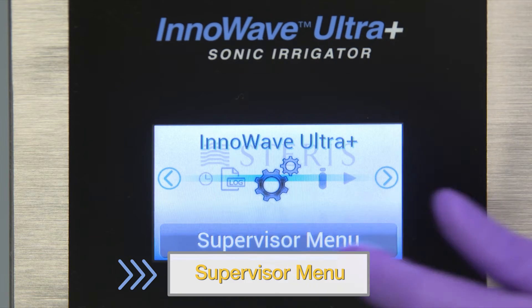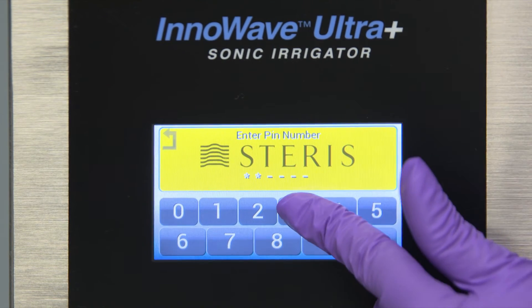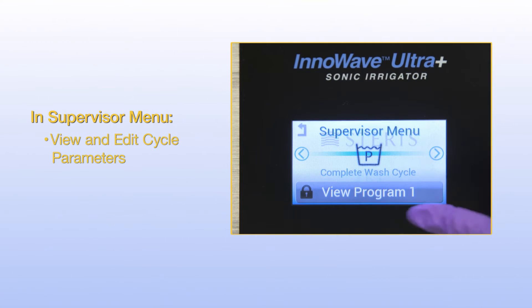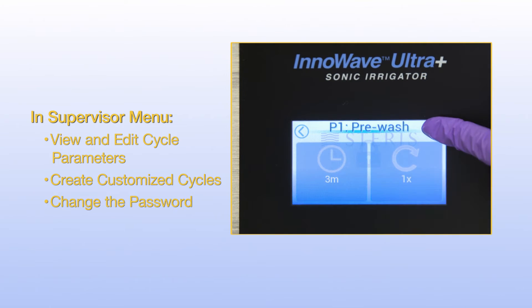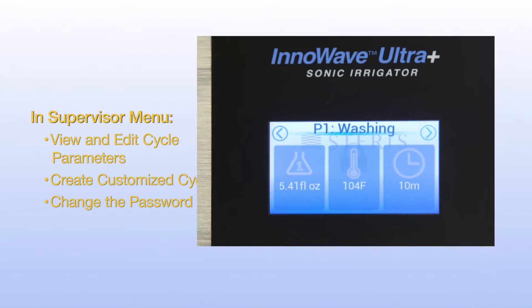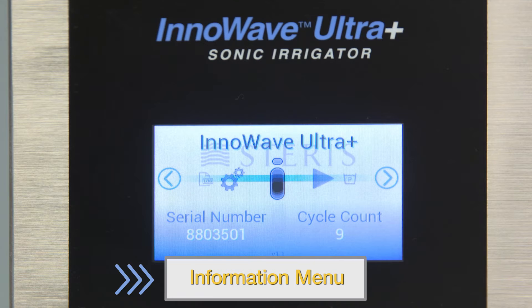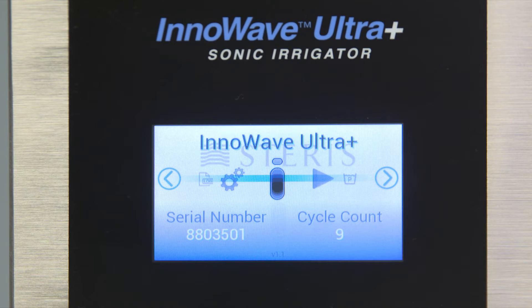The Supervisor menu is password protected and uses a six-digit code to access. Access the Supervisor menu to view and edit cycle parameters, create customized cycles, or change the password. Use the Information menu to find basic information about your unit, including the serial number, cycle count, and software version.